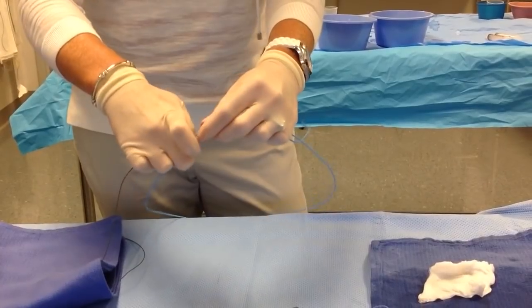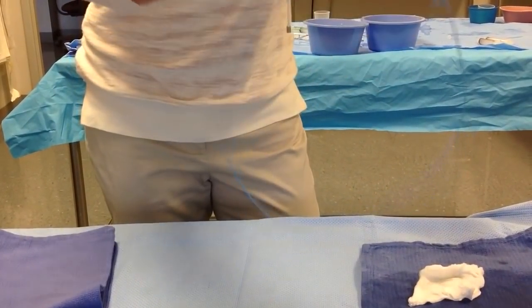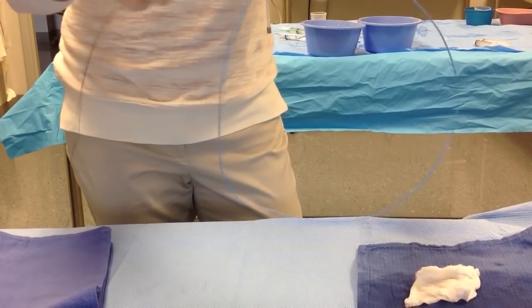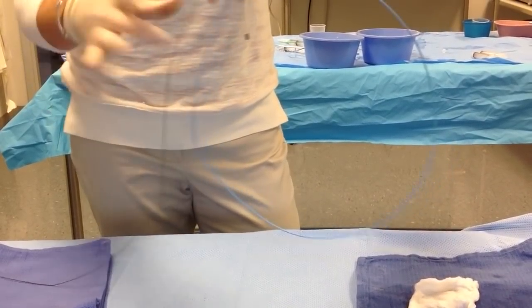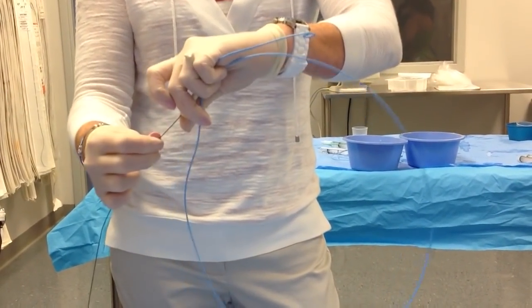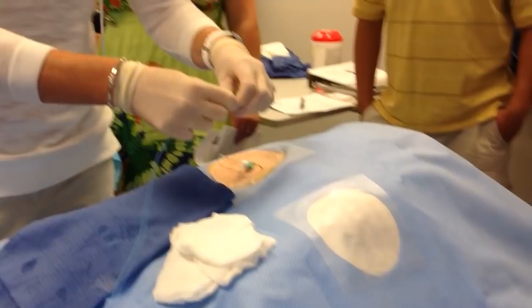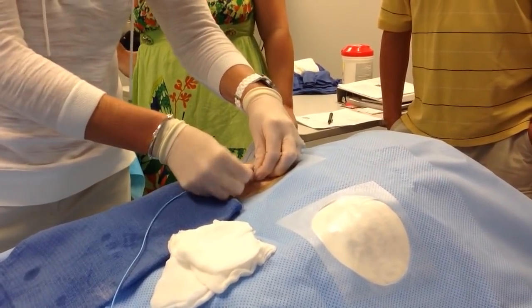Let's see. Glasses. Now, I would have a gown on, so if that did happen, it would be okay. But if it would drop below, you're not considered sterile from the waist down. So here's the end there. So I hand this off. This one's kind of hard to get in here.